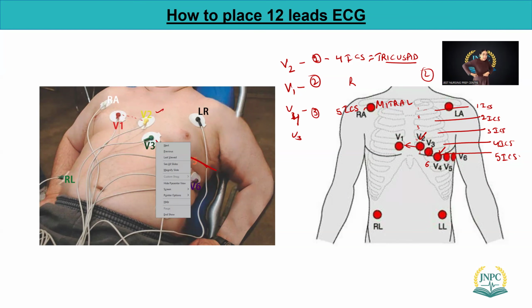Ribs are kind of like this way, right? When you feel those ribs, they are not straight, they are kind of giving this shape. So you really have to figure out, you cannot put those on ribs. It should be in between that, but follow the pattern, this slant area. I would say not straight, not flat, should be like this. If you see this guy here, it's not straight, it's following that rib line, right?